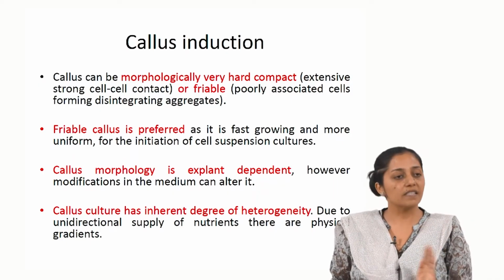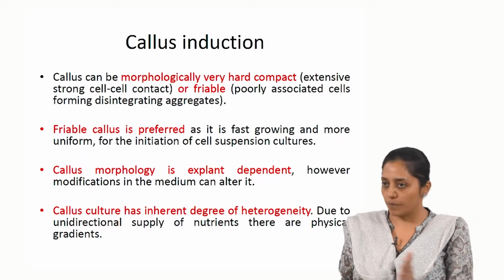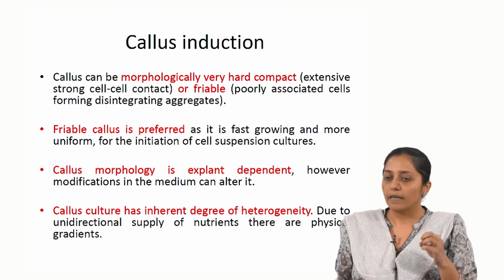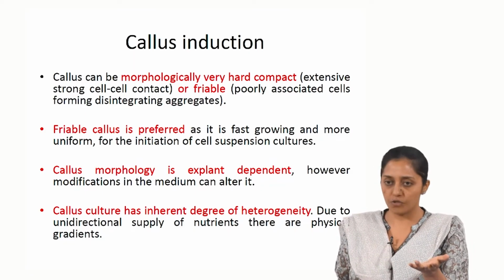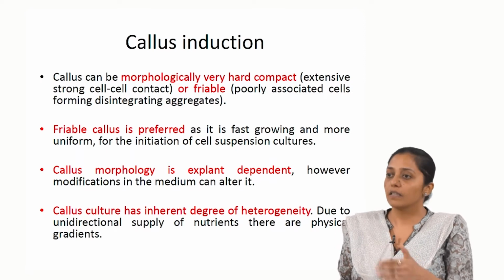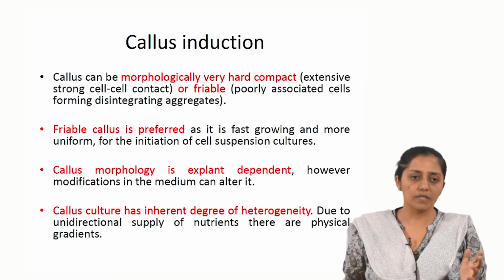Now, if you need a synchronous culture and all cells giving you reproducible results in terms of productivities, then all cells have to be given the same environment. So, if the cells get dispersed in the liquid medium, all cells are getting exposed to the same environment. So, the chances are high that the culture would be synchronous in nature, and then the mass transfer limitations which you people were referring to will also be overcome to some extent.